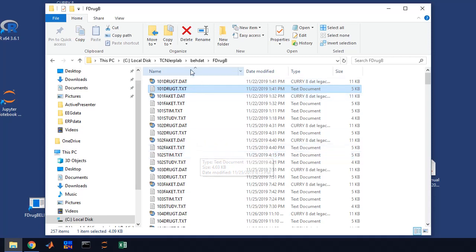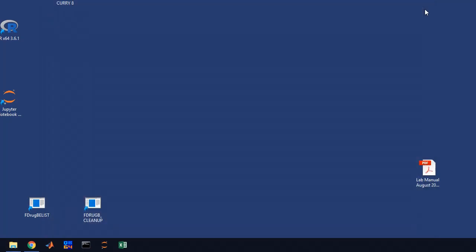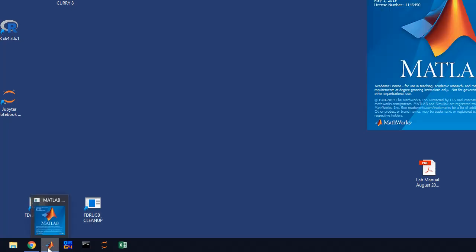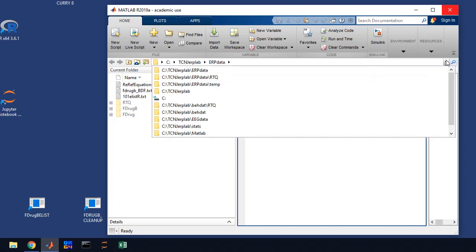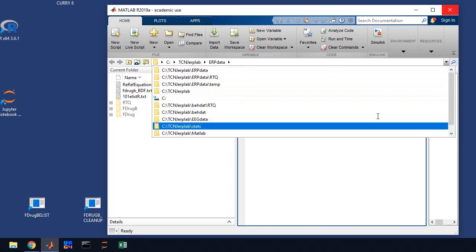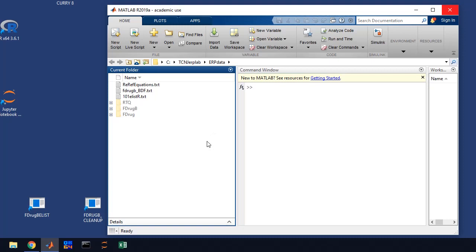The next thing you're going to do is start up MATLAB. You just click on this icon down here. MATLAB comes up and first thing you should do is check your directory. We want to be in the TCNJ ERP lab ERP data directory. You'll see files over here on the left.